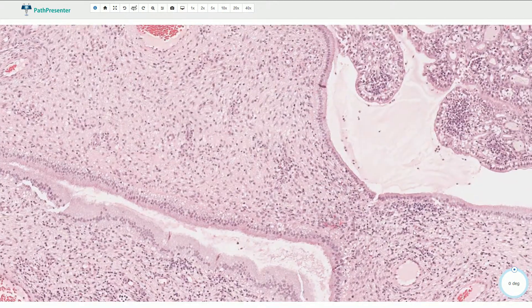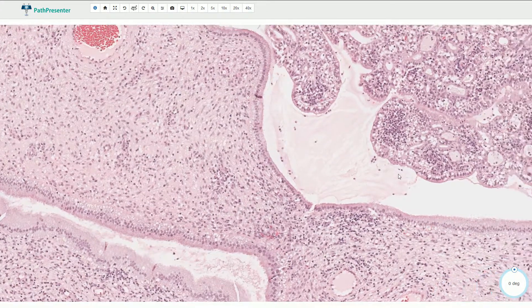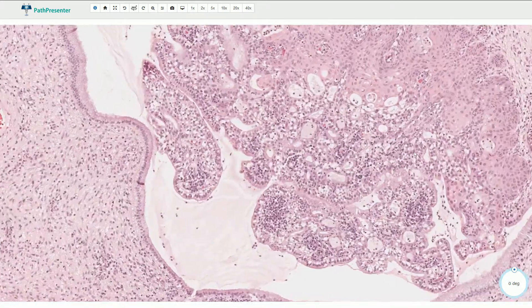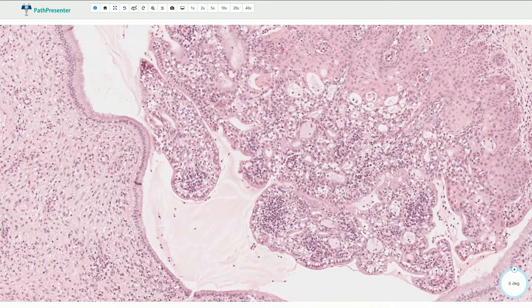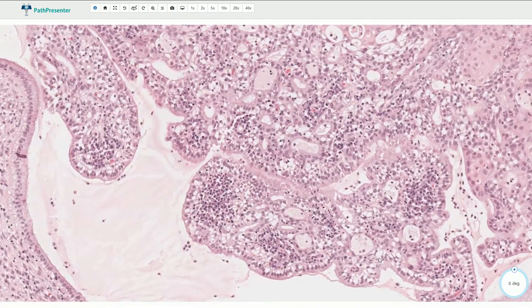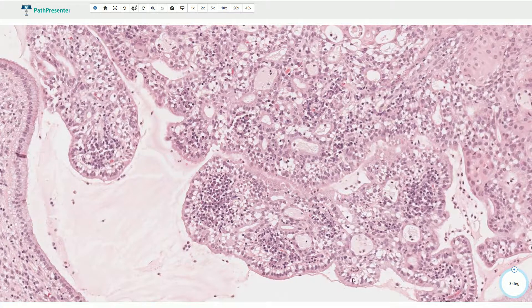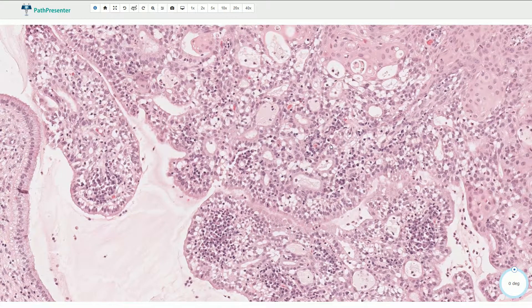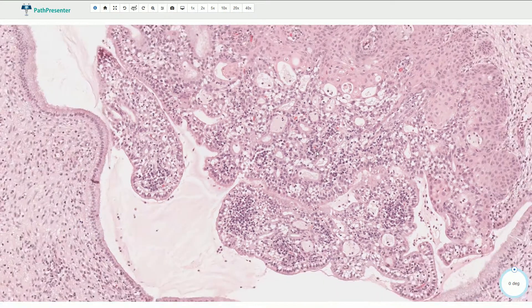The stroma can be associated with chronic or mixed chronic-acute inflammation, and sometimes we can find foci of micro glandular hyperplasia. That's what we see here. These vacuolated cells are hyperplastic reserve cells, and here we see the glands fused together.